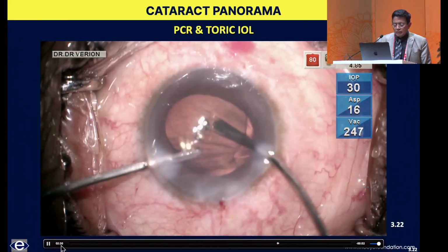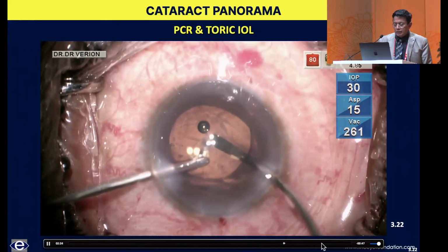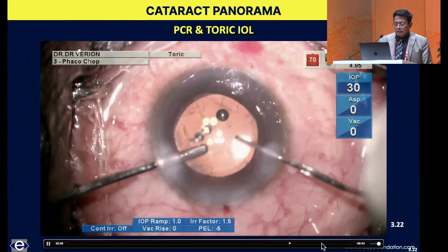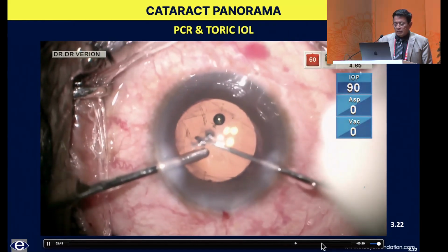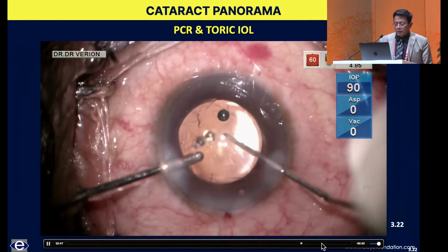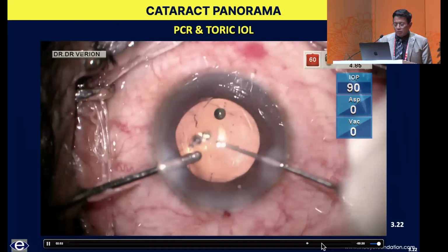There's just, then subsequently the lens being pushed in, and so optic capture being done. This is not at all what the classical teaching is, because either the haptics or the single piece haptics or the optics ideally should not be in the sulcus, and there is propensity for inflammation, raise in intraocular pressure, etc.